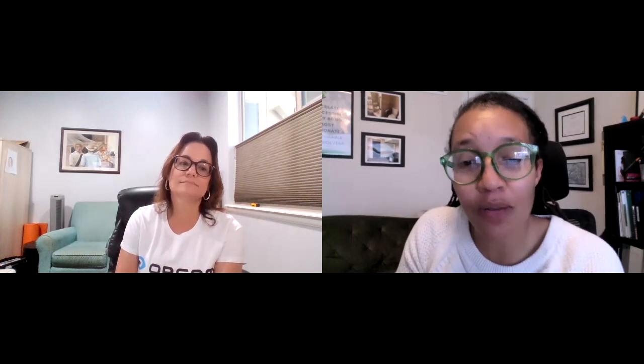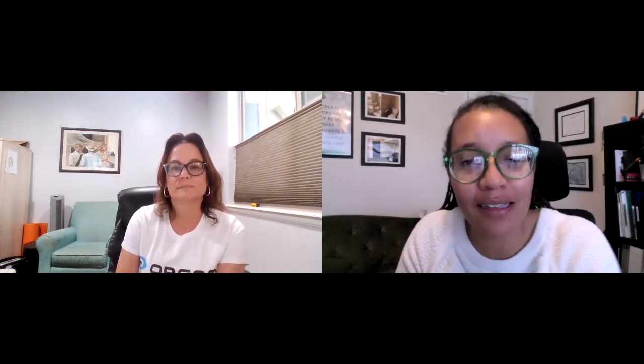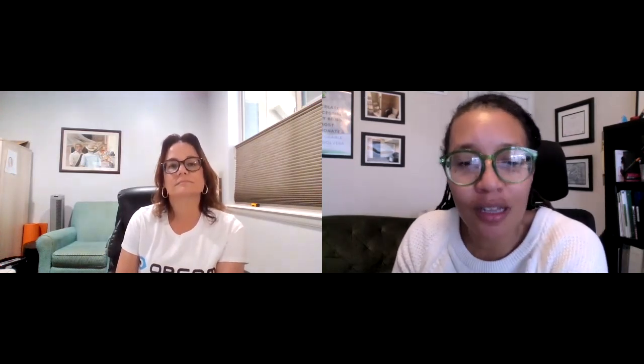So let's say somebody was Zooming with family or friends that's out of town. You could learn their faces from the screen on FaceTime or on Zoom. And then when you're in person, then you would easily know who it is. Exactly. So I appreciate this quick tutorial on some of its most basic features.